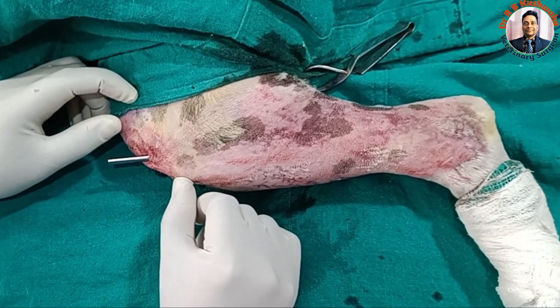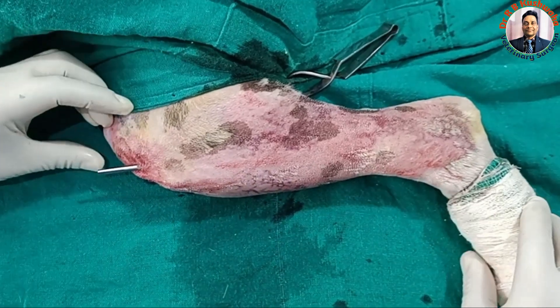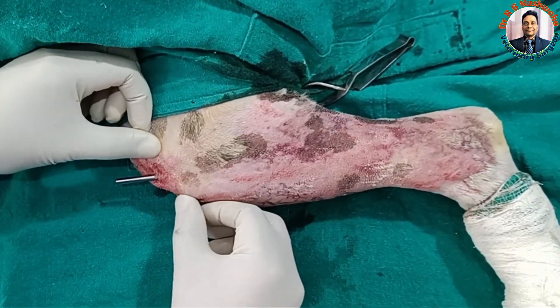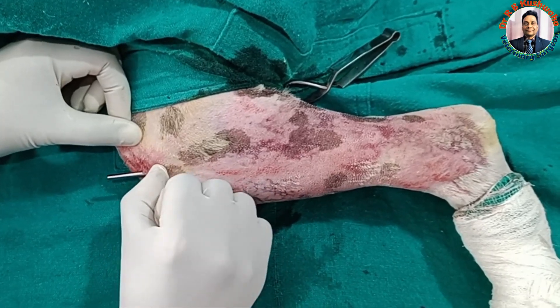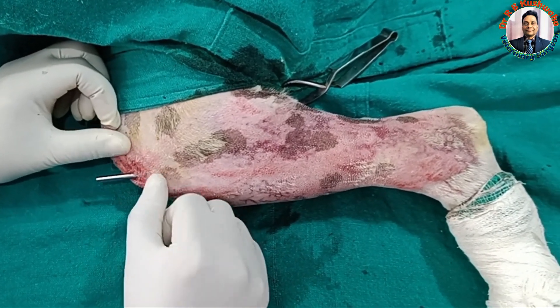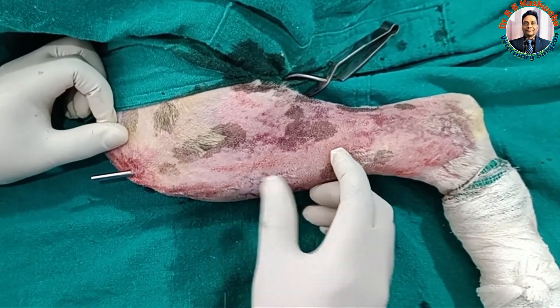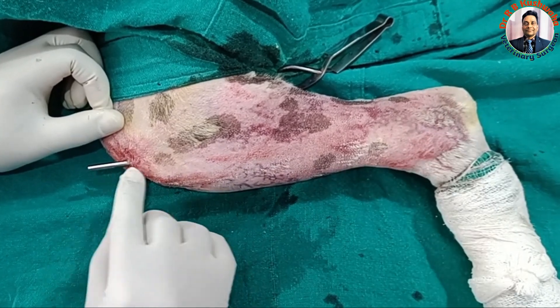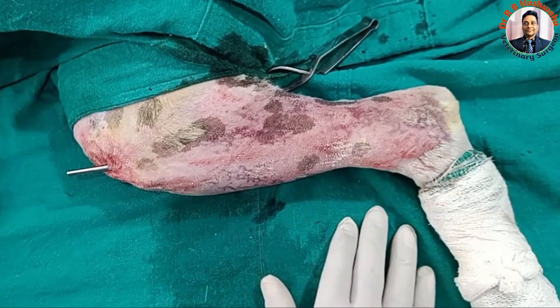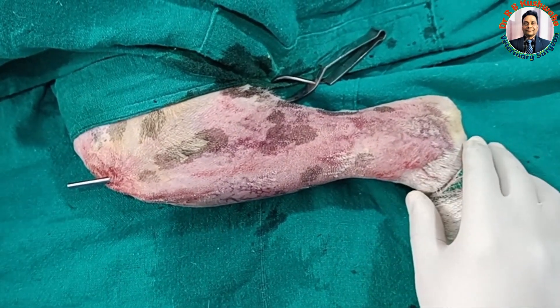This is the cranial tibial tuberosity, or anterior tibial tuberosity. This is the medial tibial tuberosity, and this here is the patella. When you feel this area and glide your thumb, you will find a depression — this is basically the site for insertion of the pin. First, we pass the pin into the proximal fracture fragment, then reduce the distal fragment, and advance the remaining pin into the distal segment.